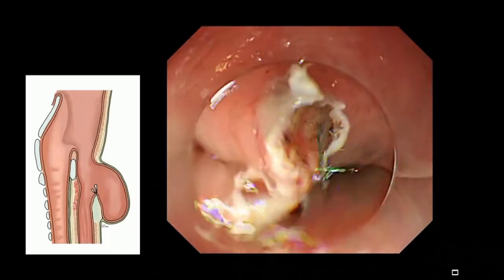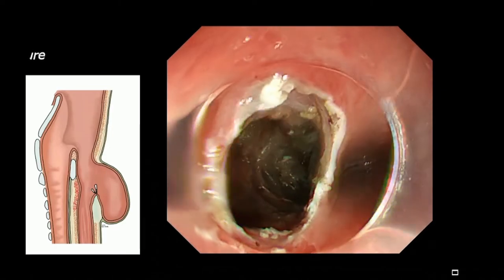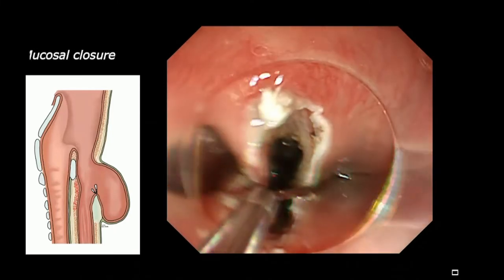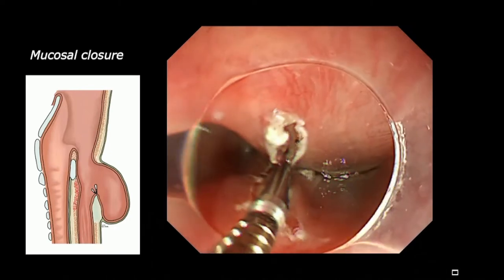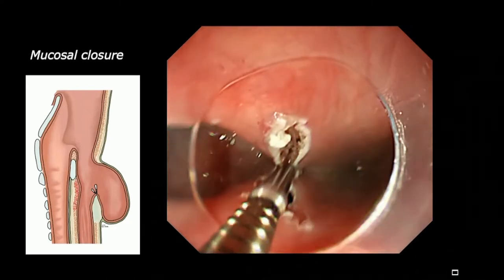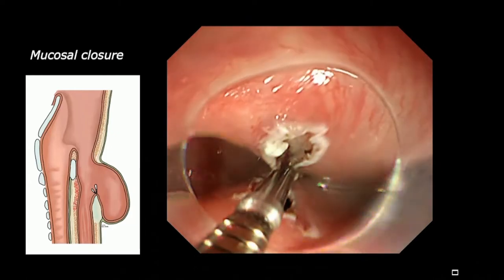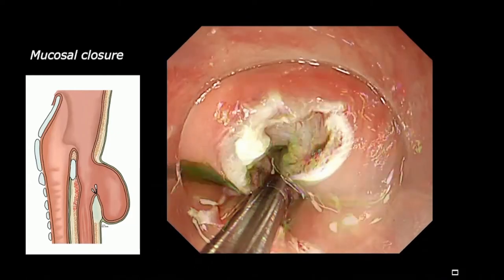The mucosal incision is just at the top of the septum, so the septum remains but without muscle. After this, we just close the mucosal entry using clips. We place the first clip at the center like a stay suture, but whatever you want, you can close.